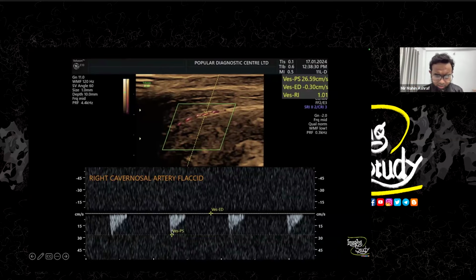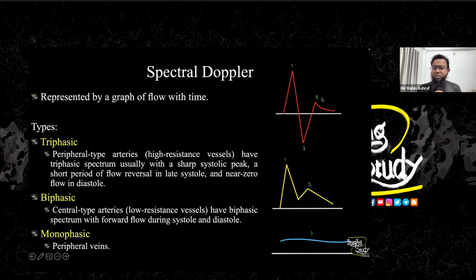You can say that, yeah, you are checking the velocity with power Doppler. No, we are not checking velocity with power Doppler. We're checking velocity with pulse wave Doppler. Okay, so by looking at the flow, we can't say the velocity is high or low. That is the principle of no speed detection with the power Doppler. Forget it.